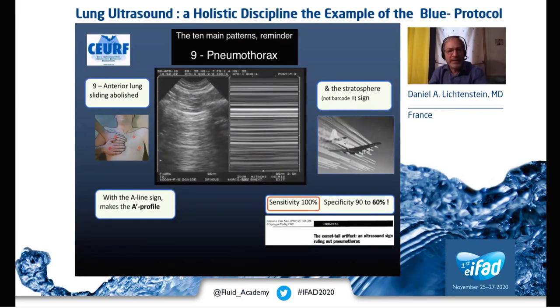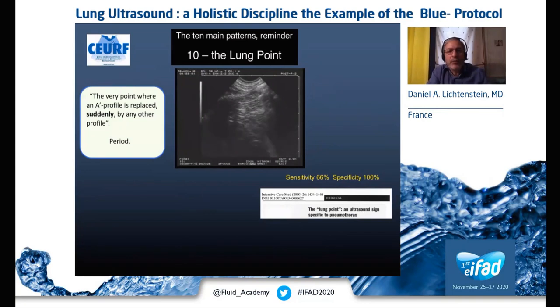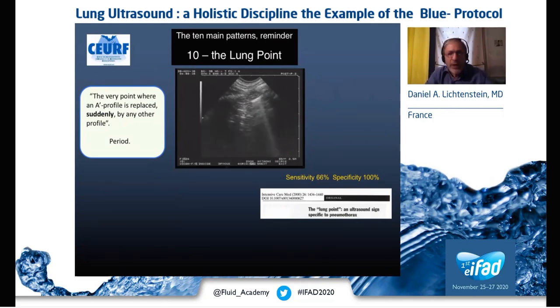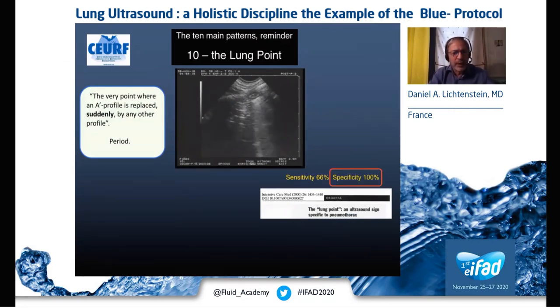The A-prime profile is not specific but is highly sensitive. If we have the lung point somewhere in the thorax — that very point where an A-prime profile is suddenly replaced by any other profile — we have the lung point, and the lung point indicates pneumothorax. This sign is specific.